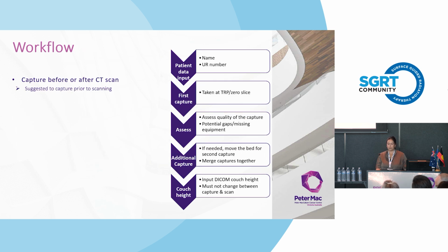So in terms of the workflow for MapRT, the first part of the process is conducted at CT. Once the patient's set up and on the bed, you input the patient data, just some basic information like the patient's name and ID number. You then take your first capture. That capture needs to be taken at your treatment reference point or your subsequent 0 slice.